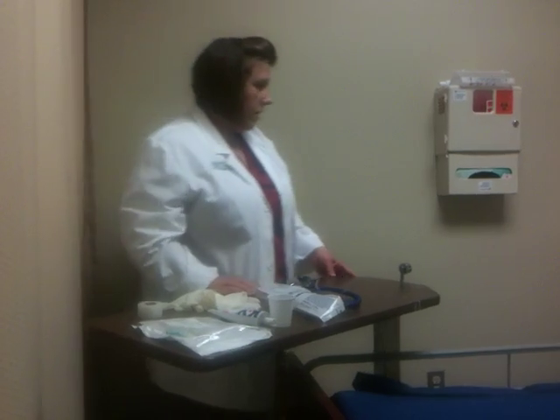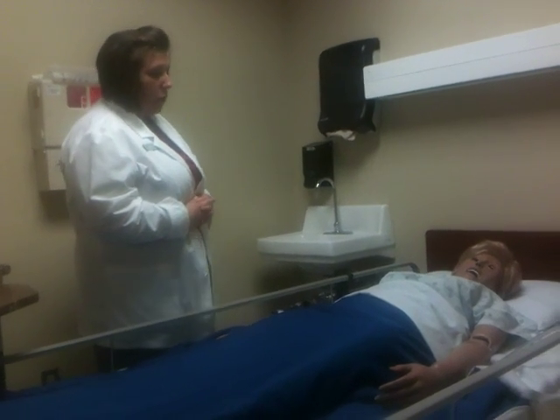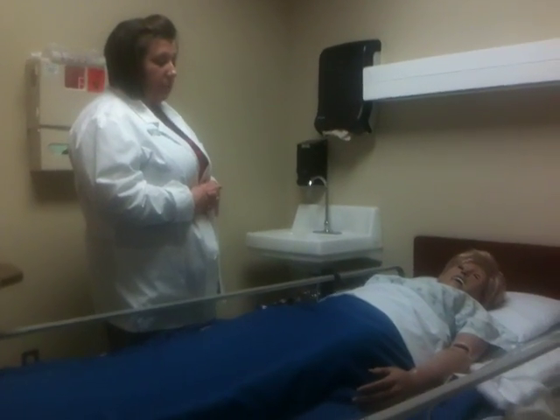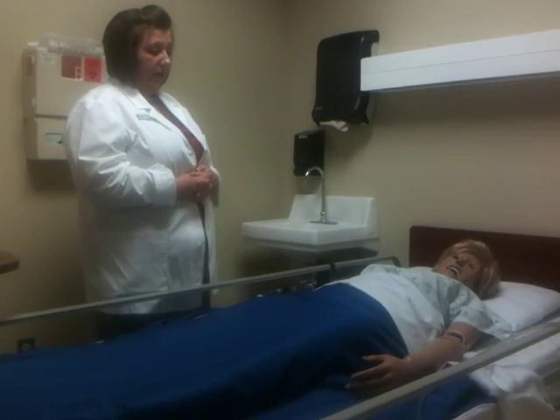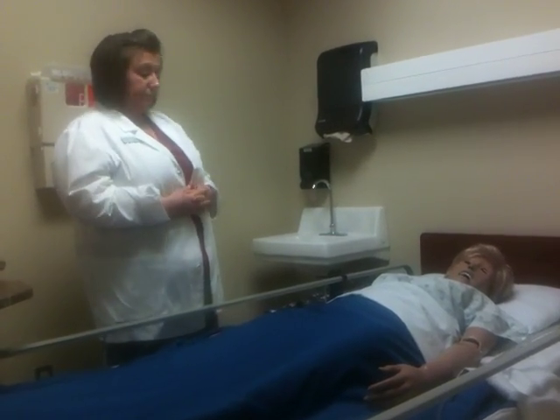So now we're ready to go in the client's room. So knock on the door. You enter the client's room. Good morning. My name is Tara. I'm your nurse today. The doctor has ordered for me to put in an NG tube to help with the nausea you've been having. Have you ever had one before? And they'll tell you whether or not they've had it.